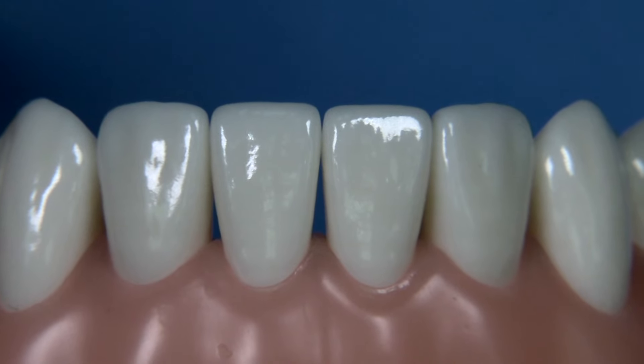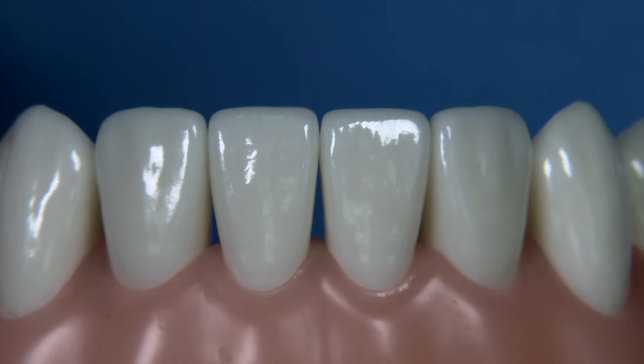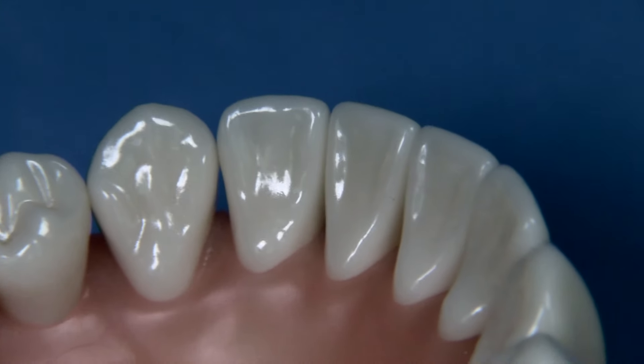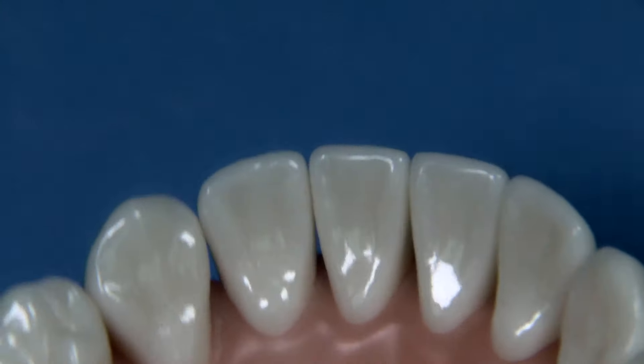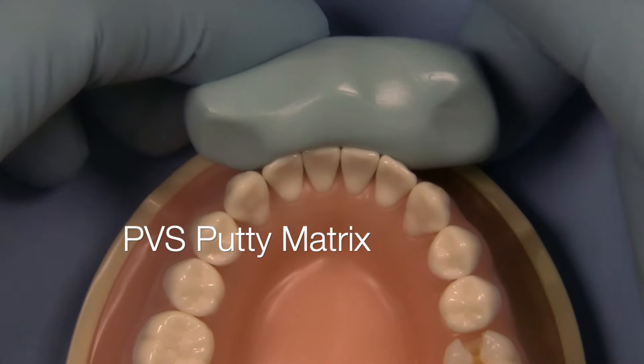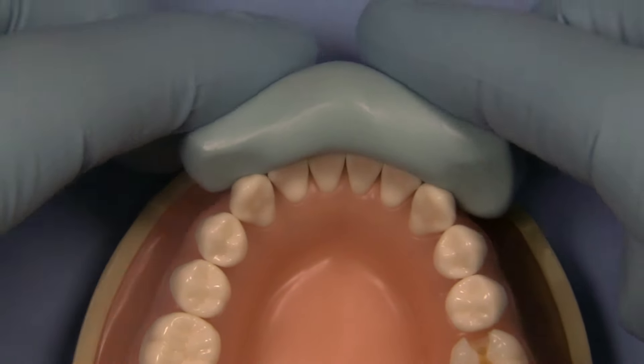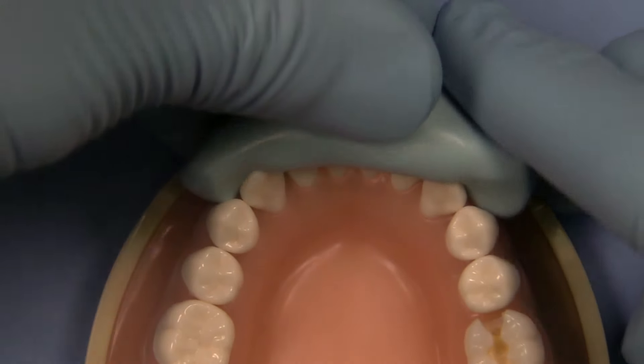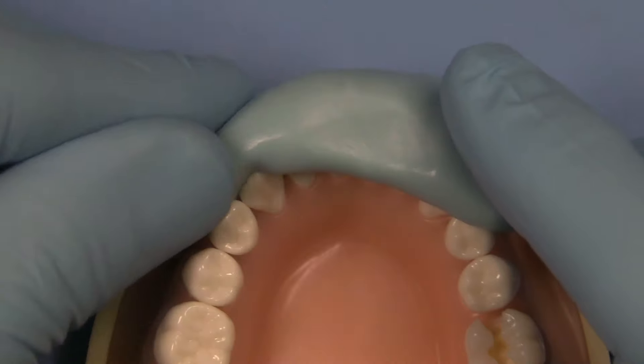So we're going to utilize the Kilgore 700 series typodont for today's project and we're going to be utilizing the burrs I've shown you from the burr block to make it really simple. I always like to start with a PBS putty matrix and I make different types of matrices for different types of veneer cases — I have about three different designs.